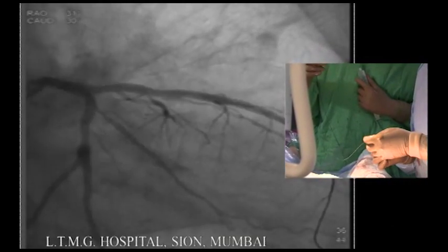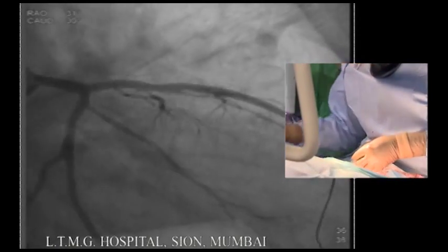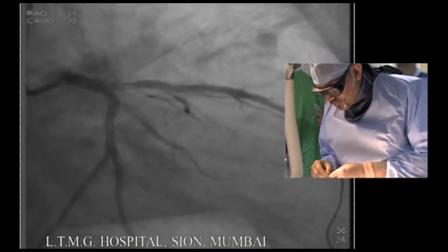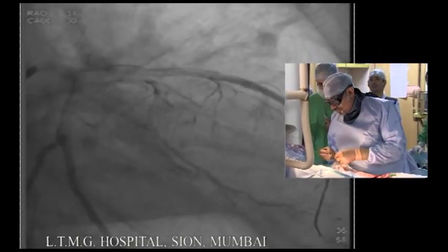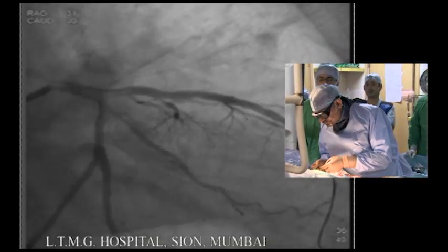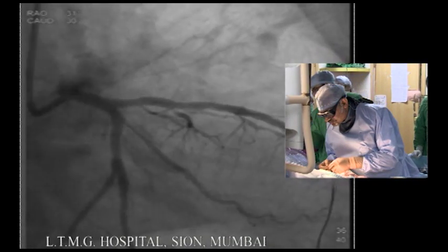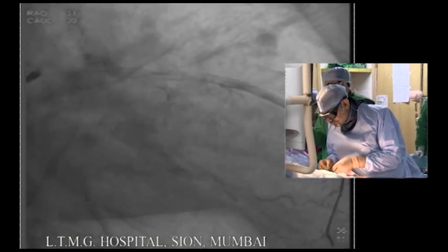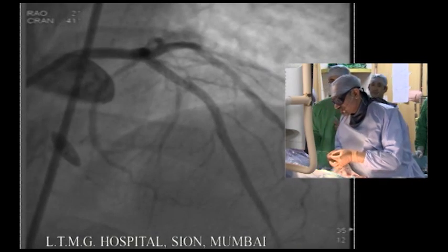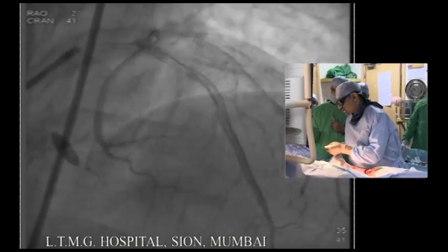Dr. Mahajan, would you also IVUS or OCT the left main and the proximal LAD, given the fact that that guideliner was sitting there for some time and that you had to push it through? Yes, I'll do that. That's a very good point. If you advance a device into the coronary, Guideliner, Guidezilla, you are obligated to establish its integrity at the conclusion of the case, because these devices can dissect. And that left main has at least 30% plaque.